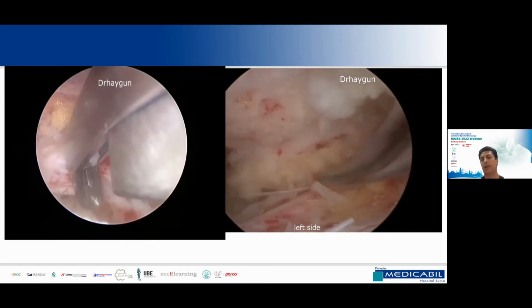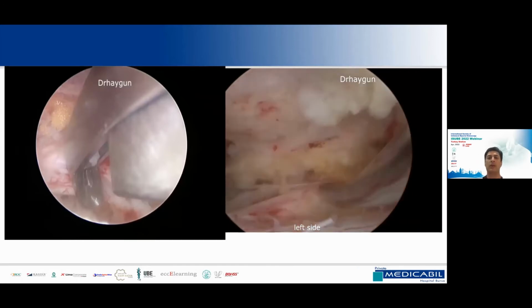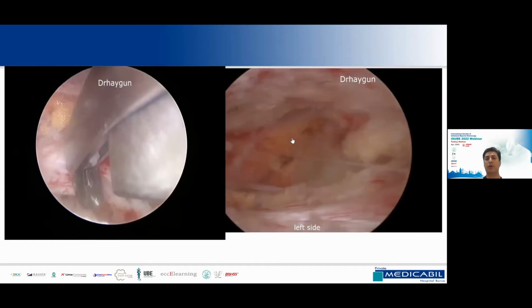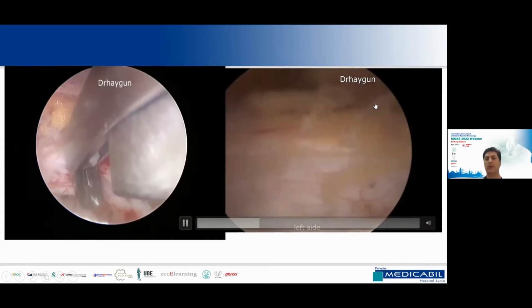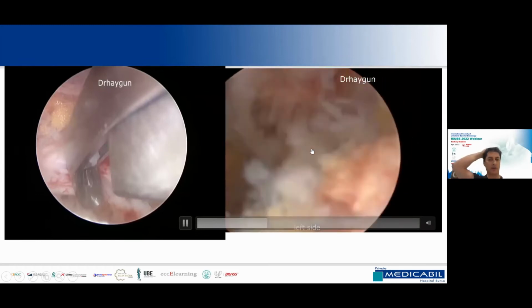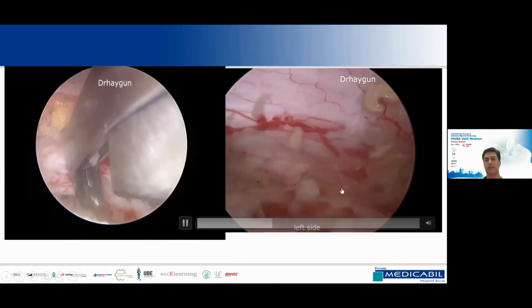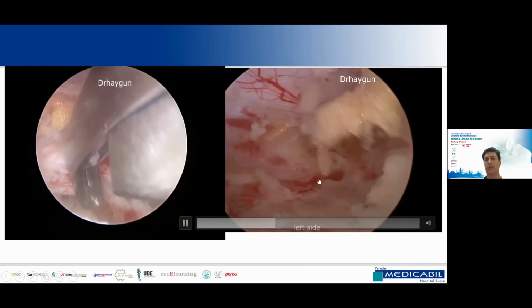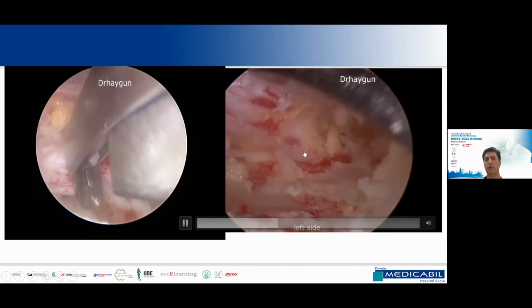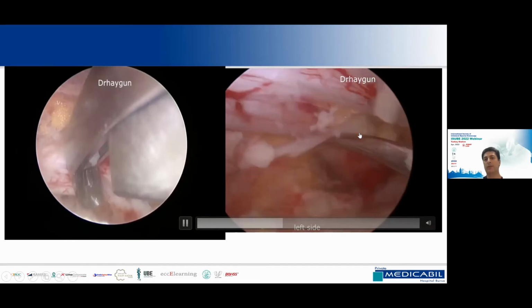In one lateral approach, we did four foraminal decompressions. You see the upper foramen, contralateral side, and lower foramen. And now here, I will show you the ipsilateral foramens. We did full decompression here. This is the upper lower nerve root here, axilla here. You see, full decompression.